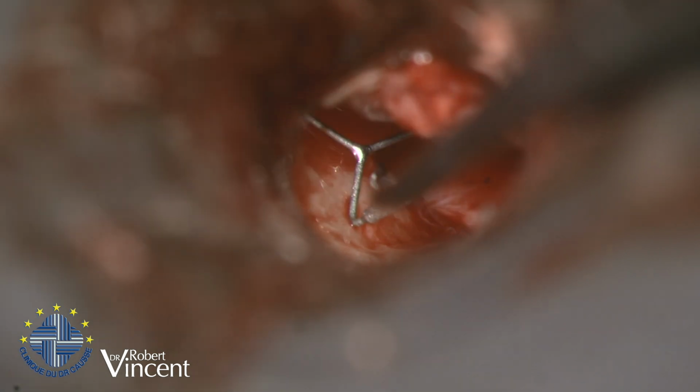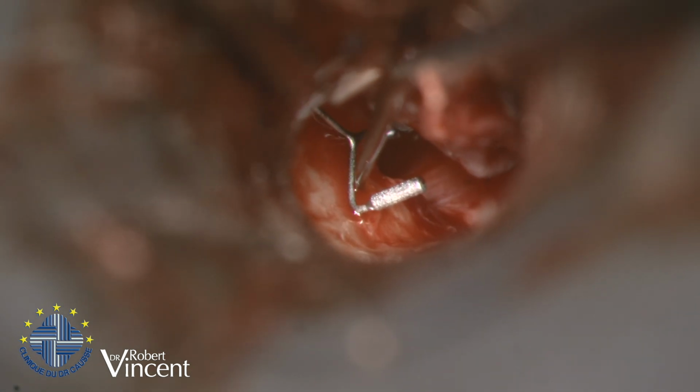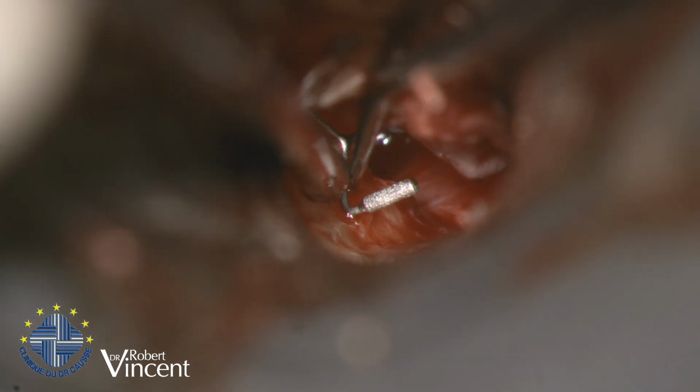So I know that I'm going to make a first hole here, because I need to avoid the facial nerve, of course, so it will be here, and then I will decide for the second one.